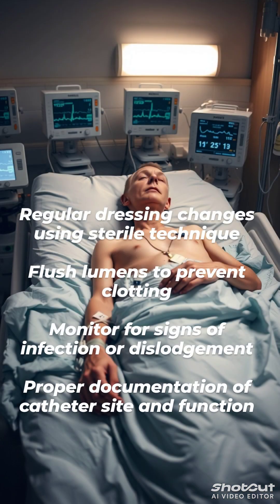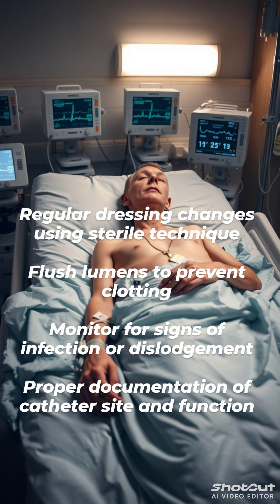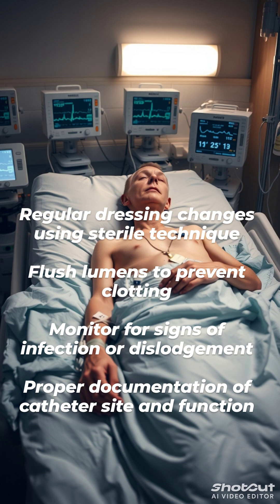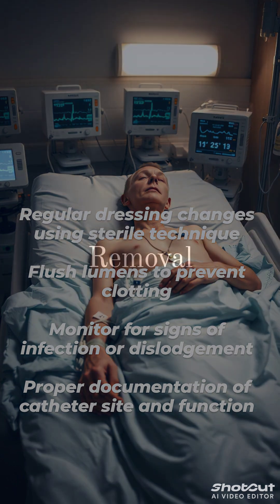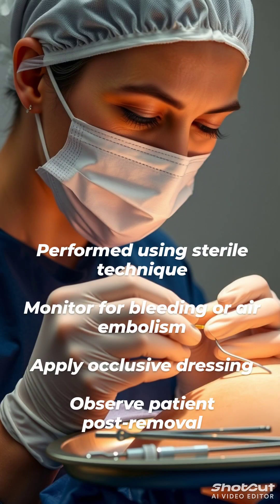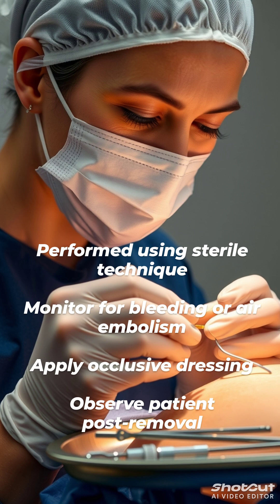Maintenance and care: Regular dressing changes using sterile technique. Flush lumens to prevent clotting. Monitor for signs of infection or dislodgement. Proper documentation of catheter site and function. Removal is performed using sterile technique; monitor for bleeding or air embolism, and apply occlusive dressing.